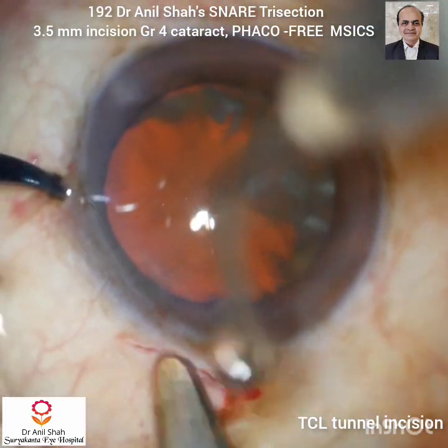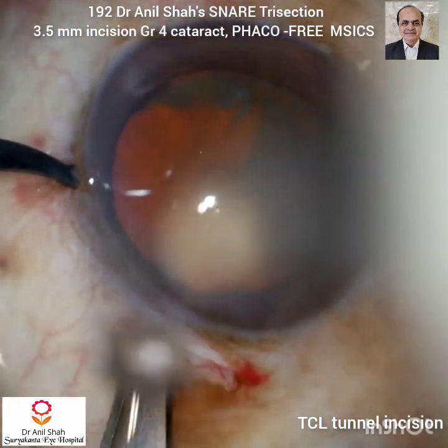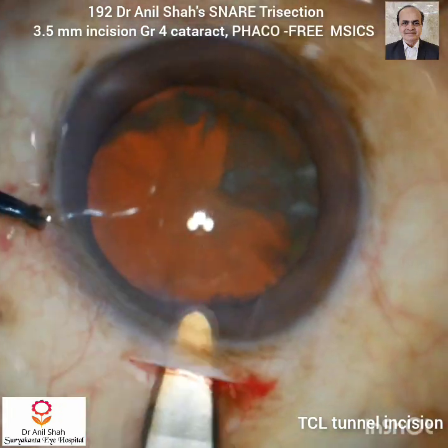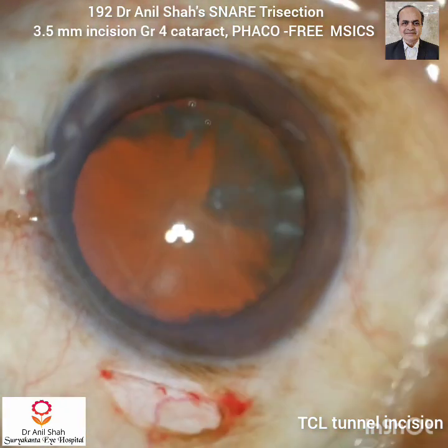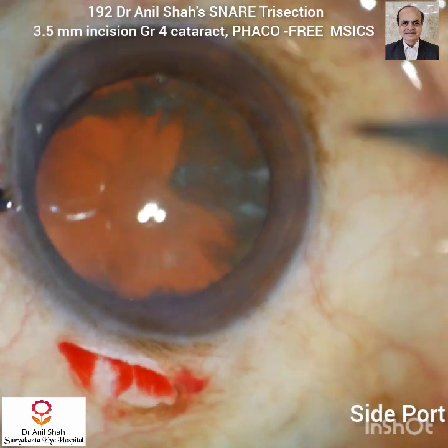But if your tunnel is more towards the scleral side, then passing the snare is difficult because you have to cross the tunnel and then go into the anterior chamber, so there is a little zig-zag movement of the snare. Because of this the chamber can collapse and engaging the nucleus is difficult.